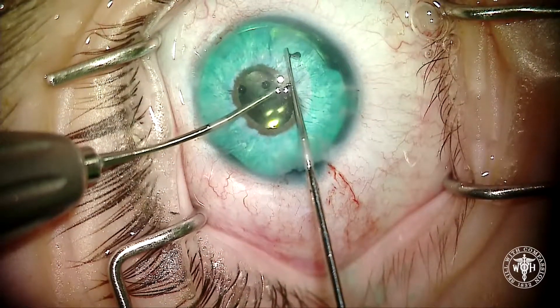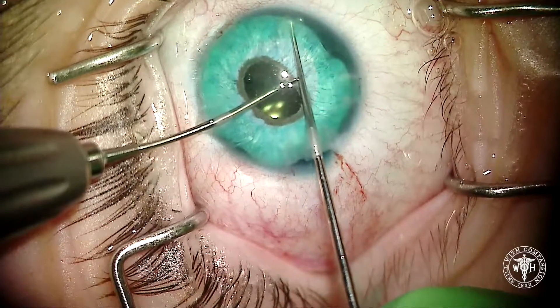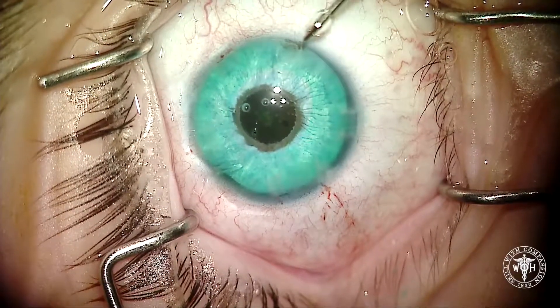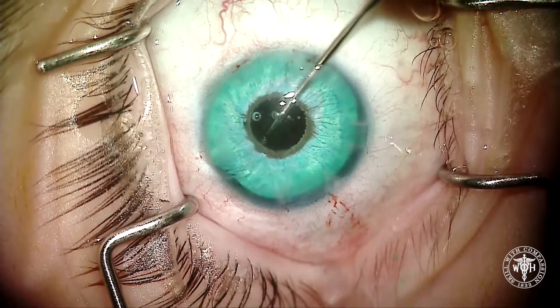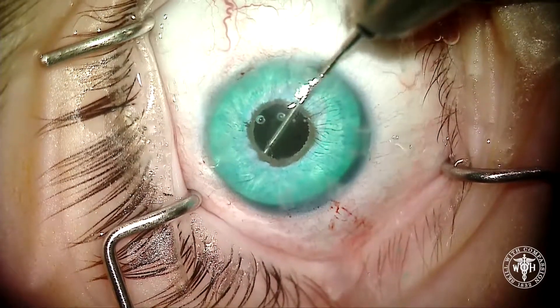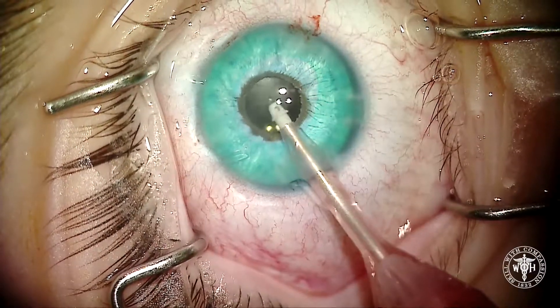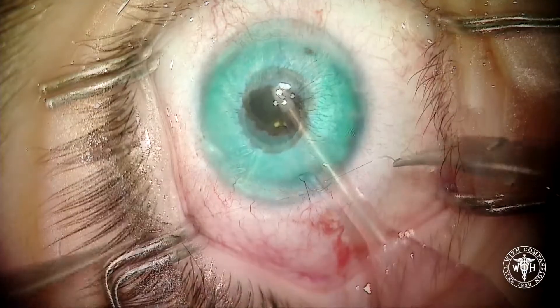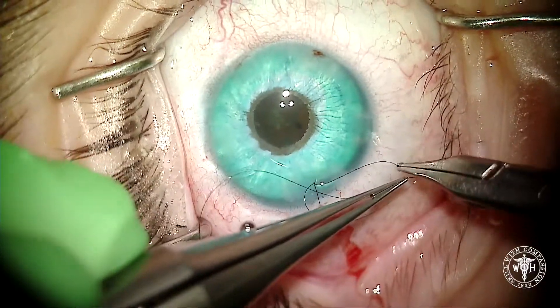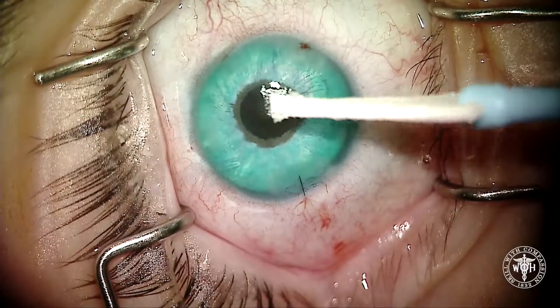You can also see why we stained the capsular bag — it's very difficult to see that edge. Sometimes the artificial iris will get stuck underneath the haptic or the CTR, so we take our forcep and carefully make sure the artificial iris is anterior, or on top of, the CTR and haptic. We then remove the viscoelastic. In these cases we do have to enlarge the incision, so a 10-0 nylon goes in to close the wound, and as long as everything has gone smoothly, we've got a nice successful case. Thank you very much for watching.